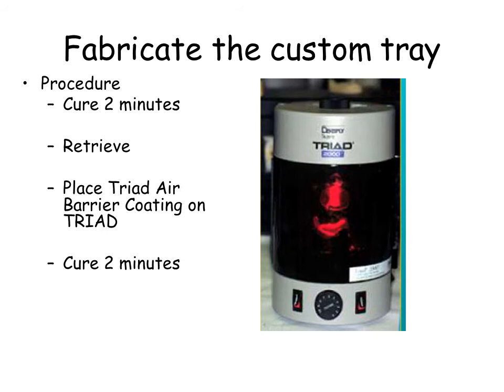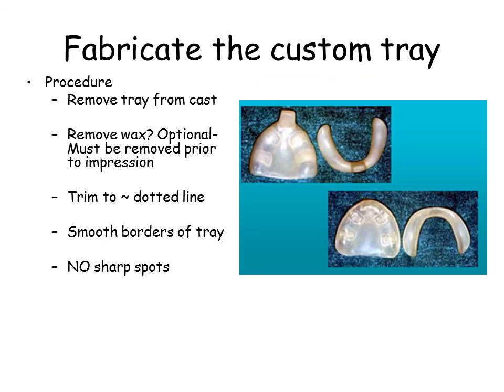Curing of the oxygen inhibited layer of the triad may be accomplished by placing a thin layer of Vaseline over the triad material and continuing to cure. The tray is then removed from the cast. Removal of the wax is optional at this point; keeping the wax may be useful in stabilizing the tray during border molding. The tray is trimmed to the dotted line, and the borders should be smooth and rounded with no sharp spots.